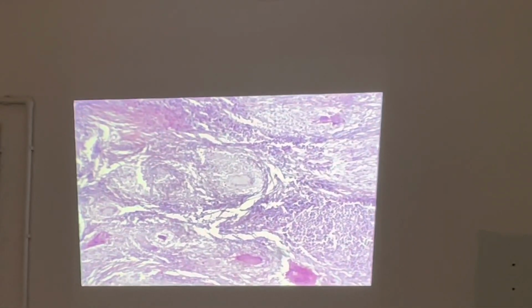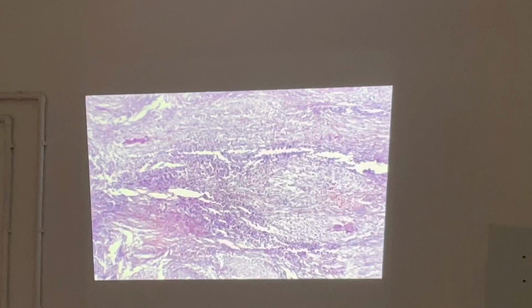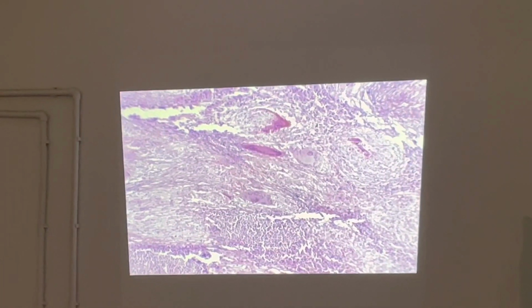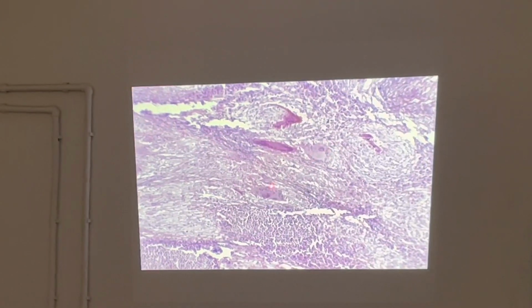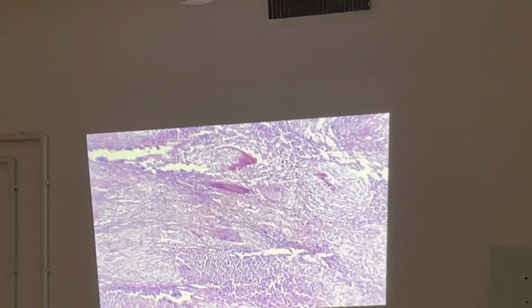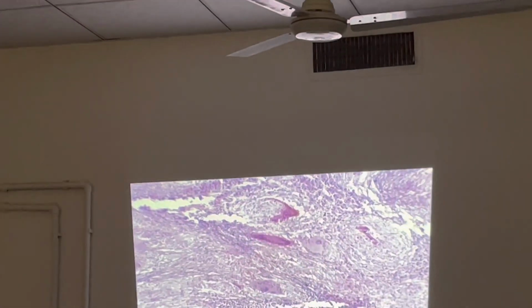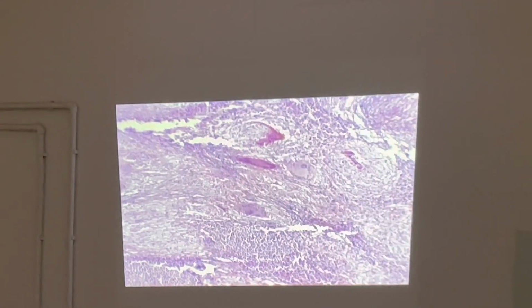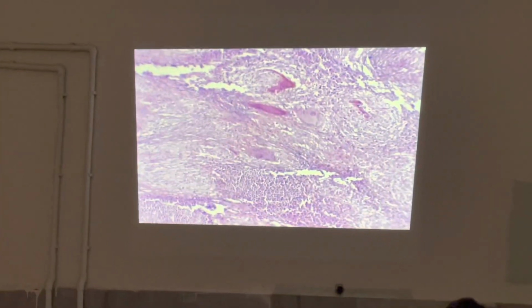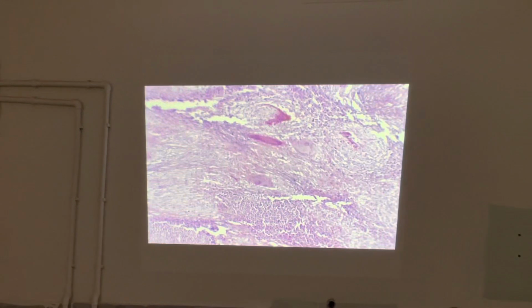When there is a nodule, how many nodules? All the lymph node parenchyma is nodules. And we have what? We have a giant cell. Take a look at the giant cell. There's granulation tissue, there's caseous necrosis. So this is what? It is a typical lesion for granuloma. Okay. The section is a lymph node. The lesion is a granuloma.